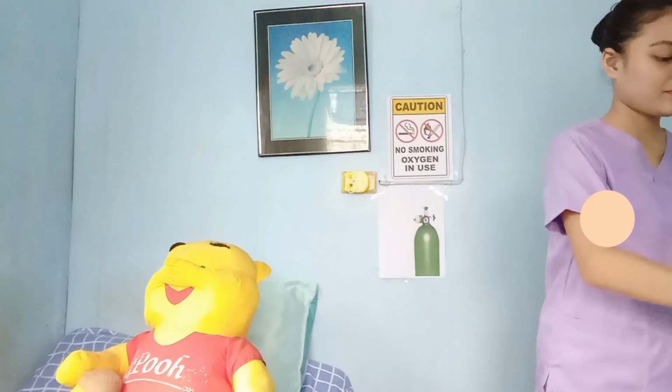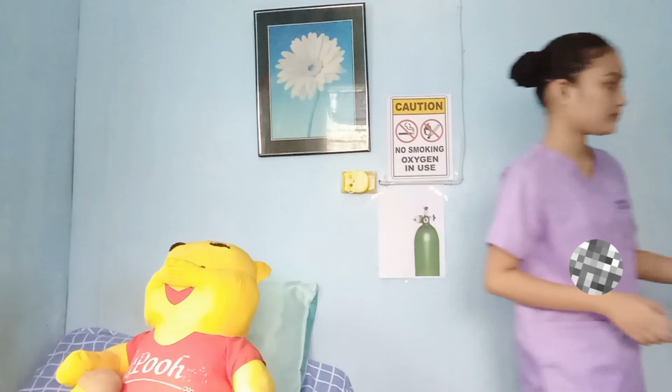Okay. After that, I am going to perform hand hygiene and observe other infection prevention procedures to deter the spread of microorganisms and to protect my patient and myself from infection and cross-contamination. Okay, now after doing that, I am going to provide privacy for my client to preserve his dignity and integrity by closing the door or curtains. This will also provide some comfort for the patient as well.